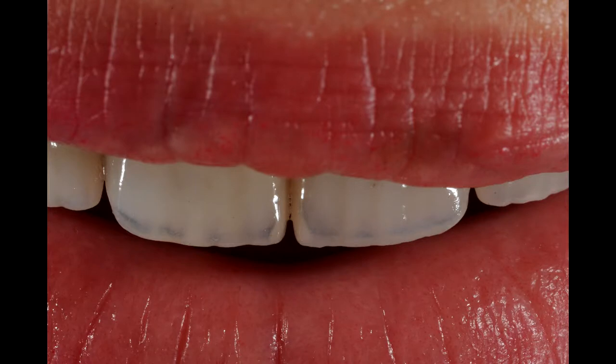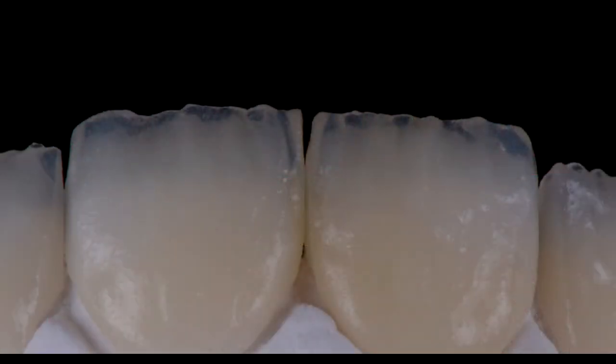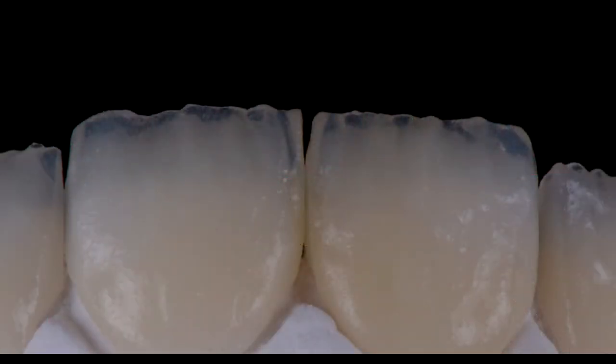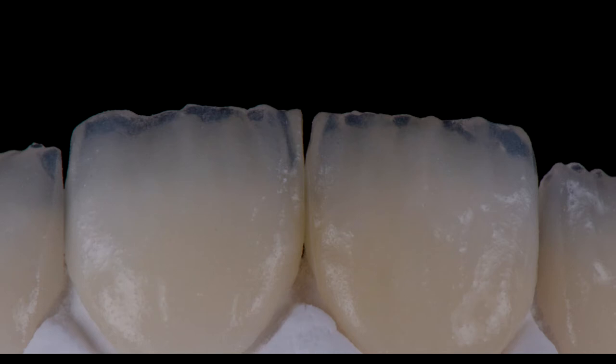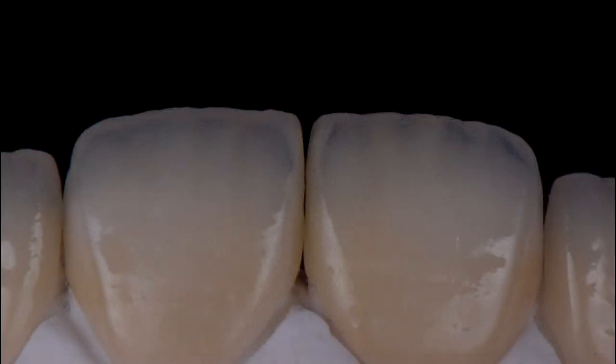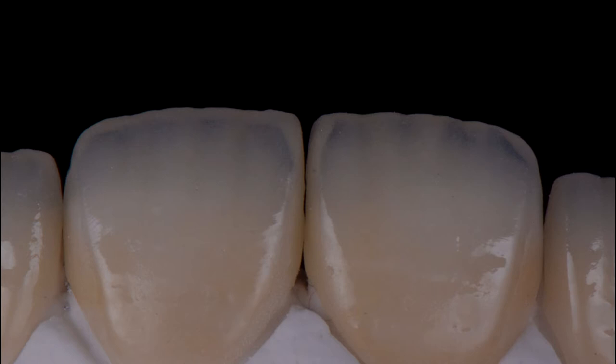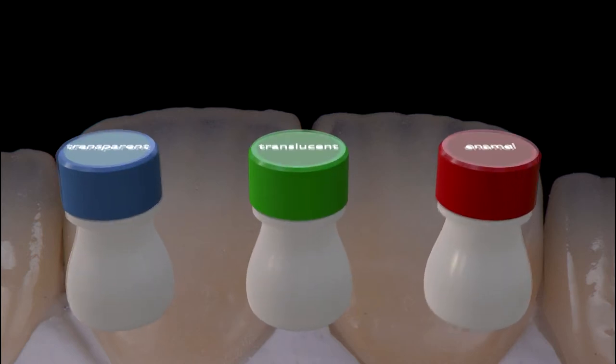For whole color harmony in aesthetic region restorations, it is vital to mimic the incisal transparency. We should send additional data to the technician for him or her to select the type of ceramic powder on this area where enamel exists only and on the whole outer surface. Moreover, we as clinicians can also use the same method for composite resins to make direct veneer restorations.